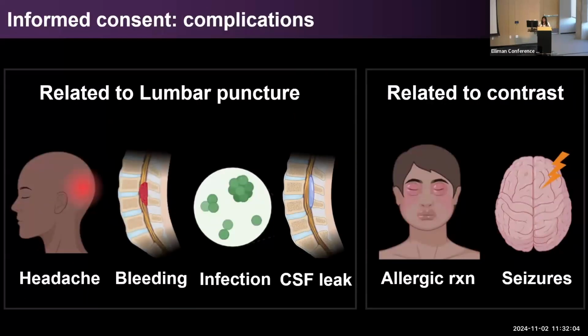Now, in terms of consent, Dr. Lutzen mentioned a lot of these, but I tend to discuss those related to the lumbar puncture. We warn that there can be headache, bleeding, infection, and nerve injury. And most CSF leak patients worry about a new leak developing at the lumbar puncture site. And we talk about the use of non-cutting, small gauge needles to try and minimize that risk.